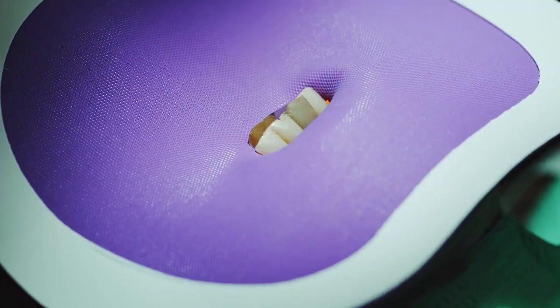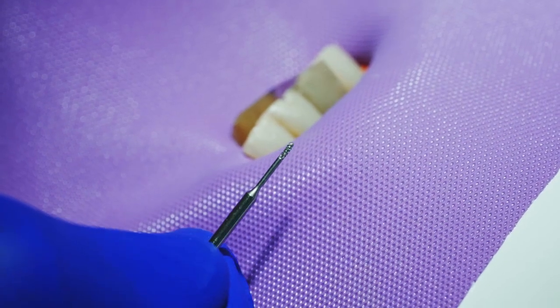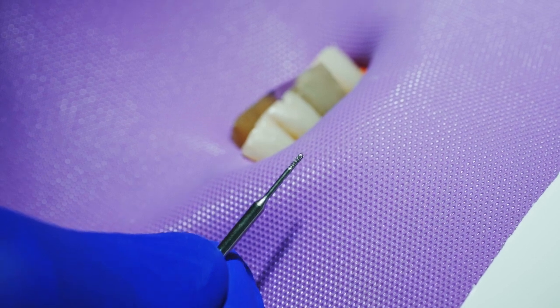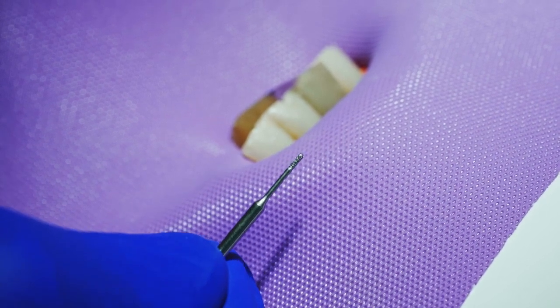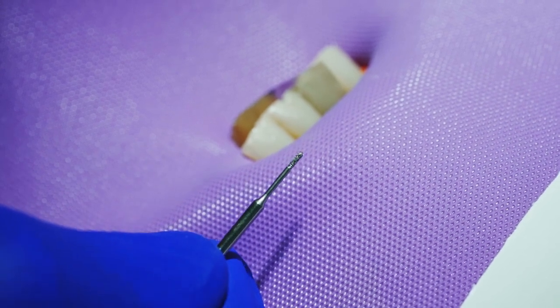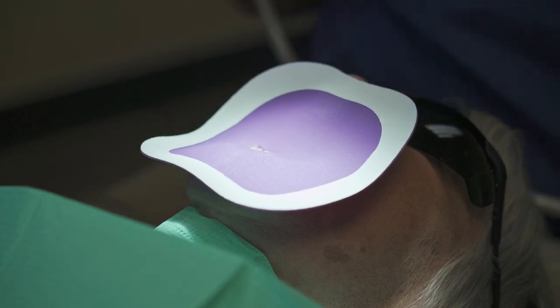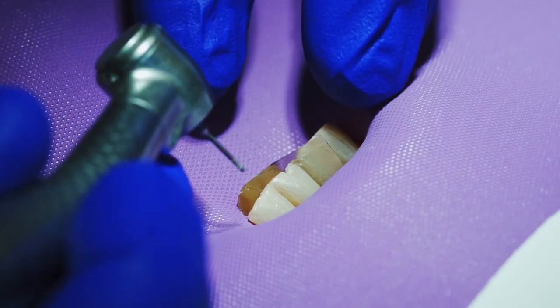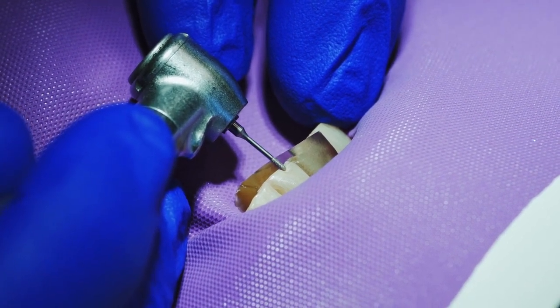We will now take the burr that comes with the kit. It's a micro pear-shaped burr, about two millimeters long, and slightly larger in diameter than the device we'll be inserting. It is a diamond, so you'll have multiple uses with this burr. Put this in the handpiece — the reason we use a burr is it's easier to cut through dentin and enamel. We'll make a small hole in this space.